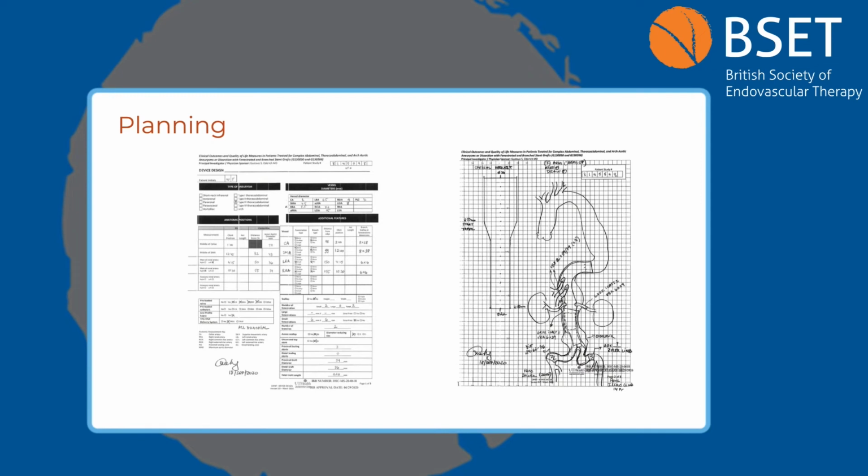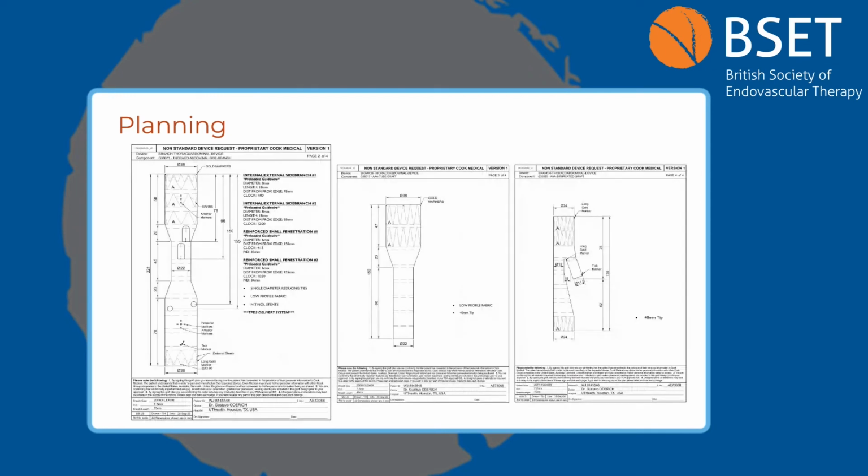Now, in retrospect, maybe that was a mistake, but this is the design that I opted for: 2 downgoing branches for celiac and SMA, and 2 fenestrations. He's also a very tall man. Note that this is a long device, and I elected to elongate it distally into that Endologix, where we could put a tapered component and then a bifurcated one.